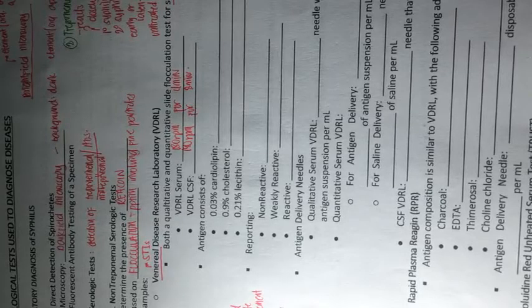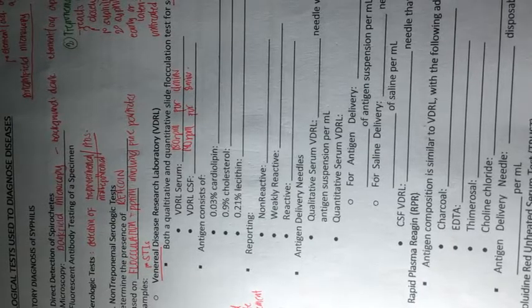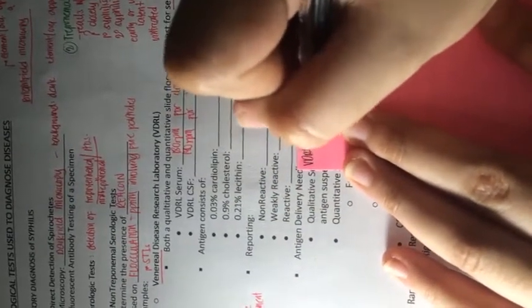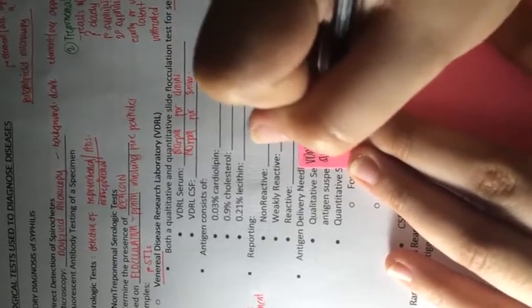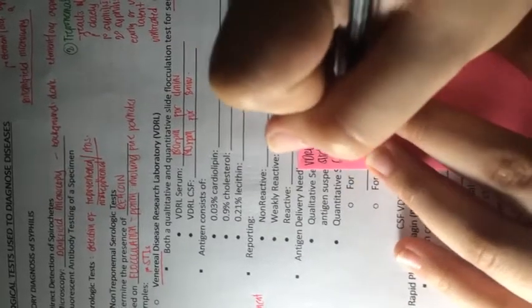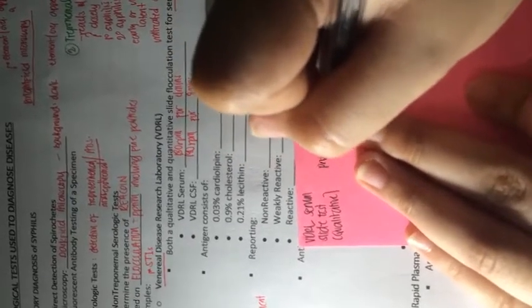For the VDRL serum slide test, qualitative, this is the procedure.